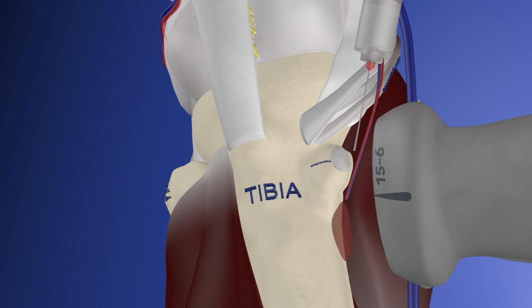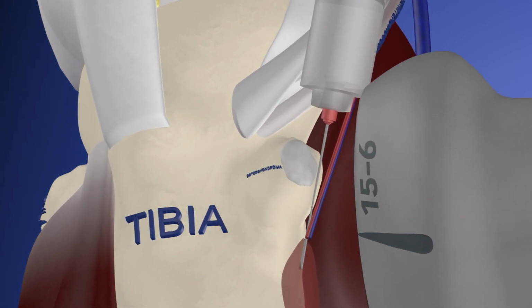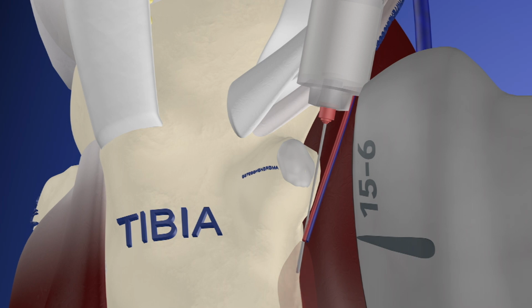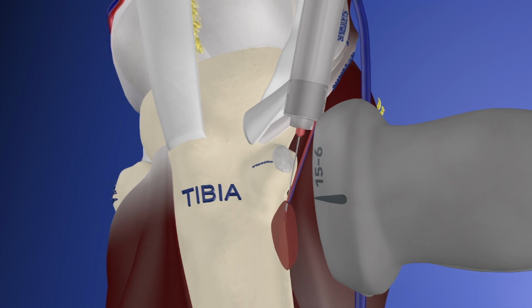This is where she was tender, so we decided to do an ultrasound-guided cortisone injection, which you can see here. The needle is going from a proximal to distal direction. The probe is orientated long axis to the needle. Here the fluid collection is somewhat translucent and we're injecting the cortisone. And here again is that fluid collection without that translucency.